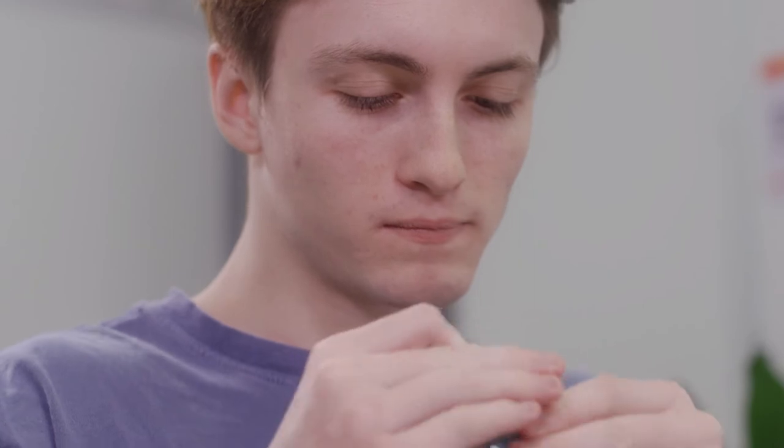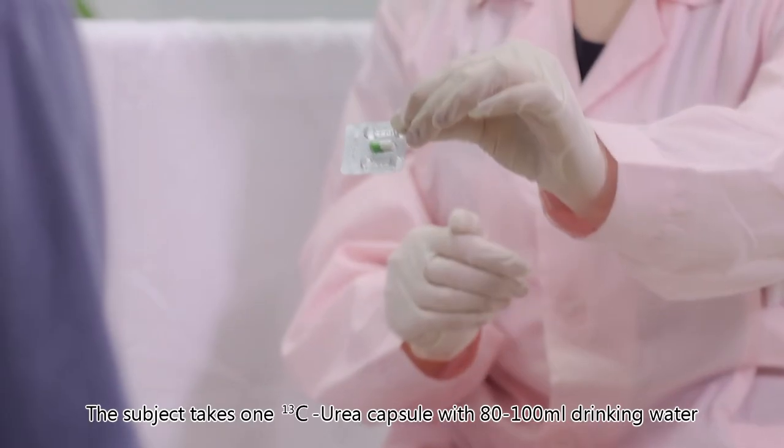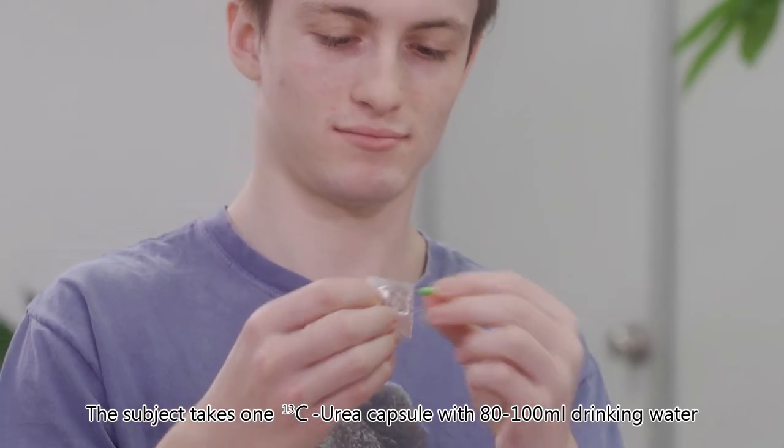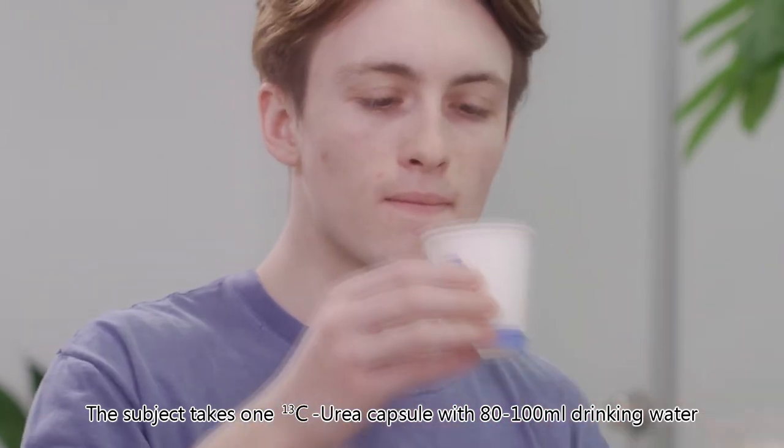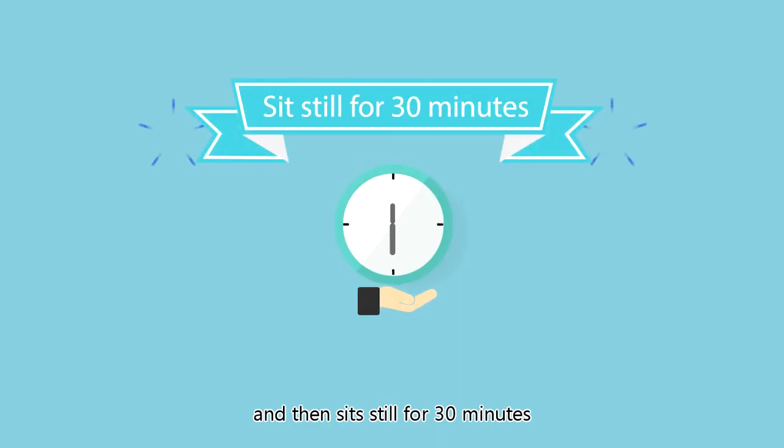The subject takes one carbon-13 urea capsule with 80 to 100 milliliters drinking water, and then sits still for 30 minutes.